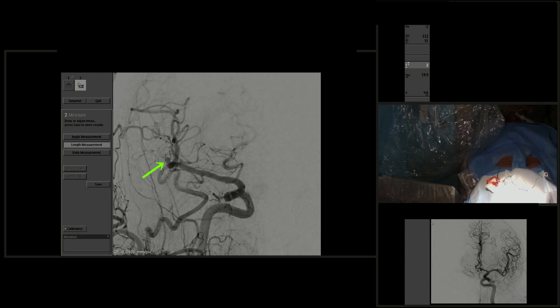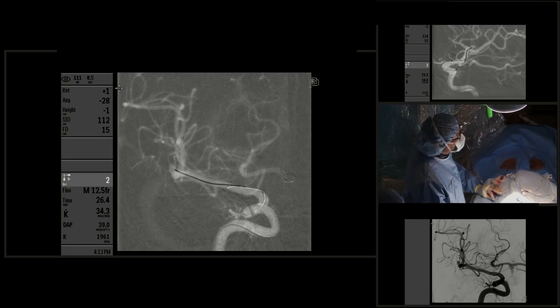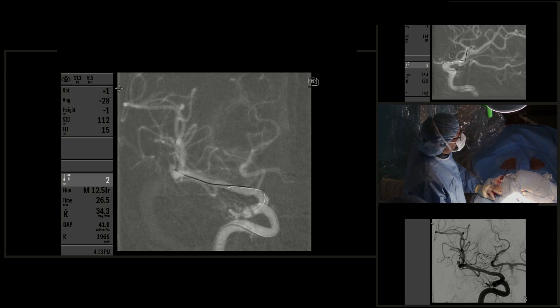Then we went to the contralateral side. This is the right internal carotid artery angiogram in AP view, demonstrating the small aneurysm of the right MCA bifurcation. Based on the hemorrhage pattern seen on CT scan, the most likely source of bleeding was the anterior communicating artery aneurysm. However, since the patient had multiple aneurysms and the risk of hemorrhage from this smaller aneurysm, we decided to treat it as well.